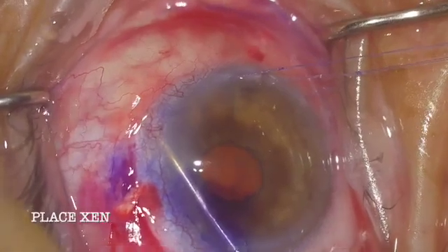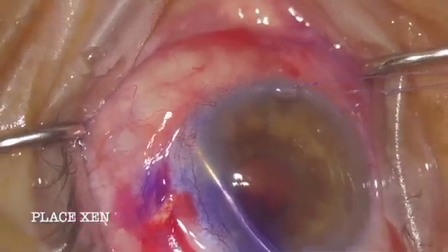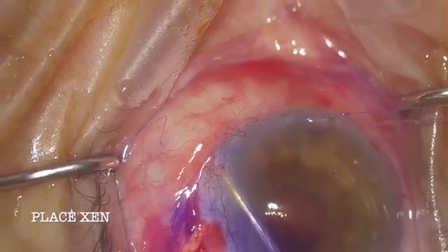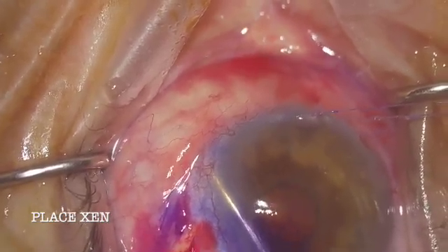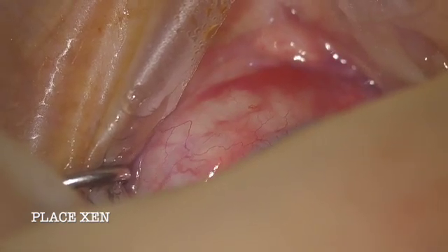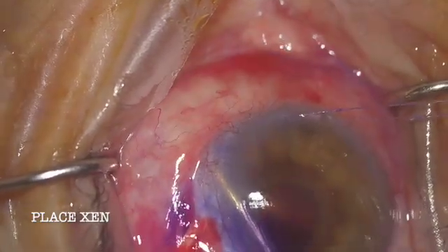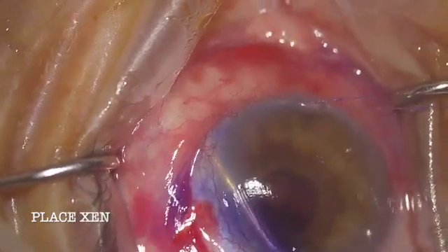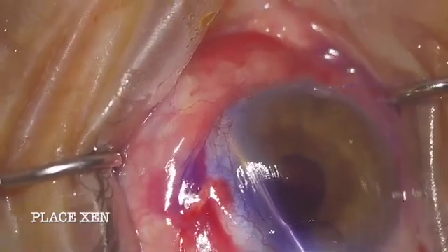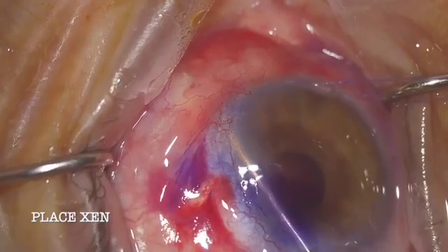Here we are placing the Xen, going as close to the 12 o'clock position as I can. I've increased exposure to get the best angulation through the 1.8 millimeter wound and into that superior space. I'm feeling my way through the angle, slowly twisting and progressing through the sclera until I can see the tip of the injector emerge. I've already inked the tip of the Xen — nice tip from our Allergan rep — so as it emerges through the sclera I can see the metal tip and then do my two-handed release. With one finger I can increase counter-traction and with two hands I can gently guide and feel my way through.